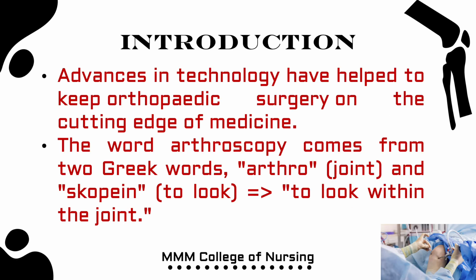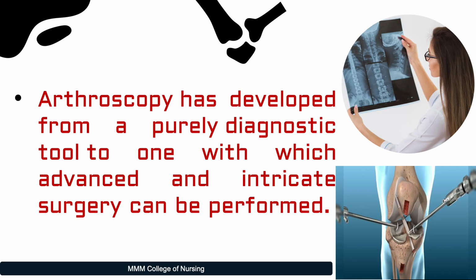Advances in technology have helped to keep orthopedic surgery on the cutting edge of medicine. This is particularly true for arthroscopic surgery. The word arthroscopy comes from two Greek words, arthro, meaning joint, and skopein, to look. Thereby, it literally means to look within the joint. Initially, arthroscopy was used purely as a diagnostic tool. Now, with recent advancements, it can be used to perform intricate surgery as well.